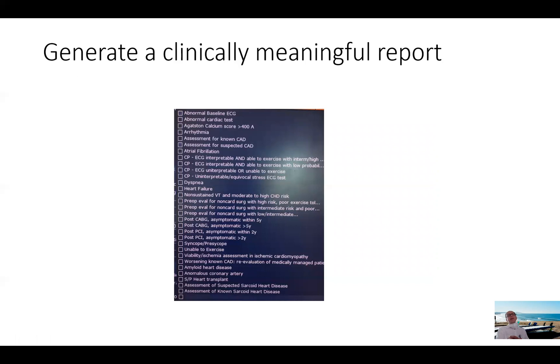More importantly, and finally, we have to generate a clinically meaningful report. In our system, at our center, we use the AUC, the appropriate use criteria for myocardial perfusion imaging, as an indication for the test. So these are all listed right here. And we have some special ones that are not addressed by the AUCs. One of them is amyloid heart disease, anomalous coronary arteries, heart transplant, sarcoid, known and unknown. So these are specialty, subspecialty things we look at. So we capture them within our system.